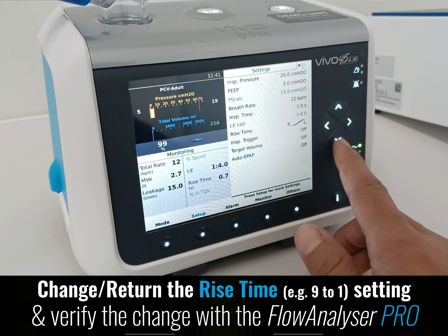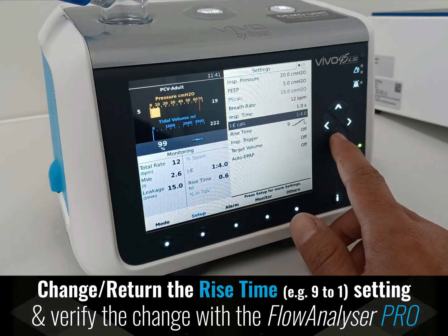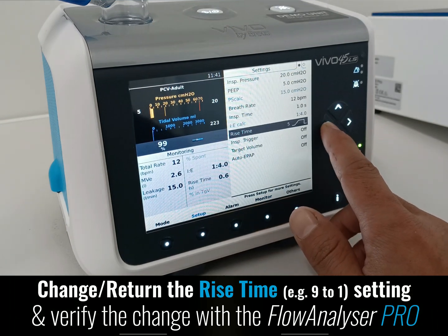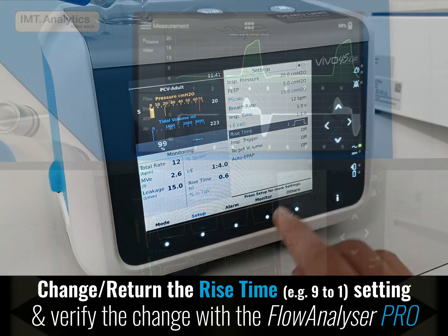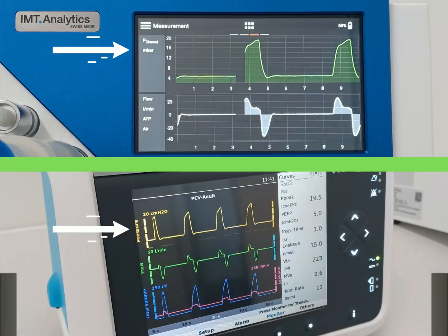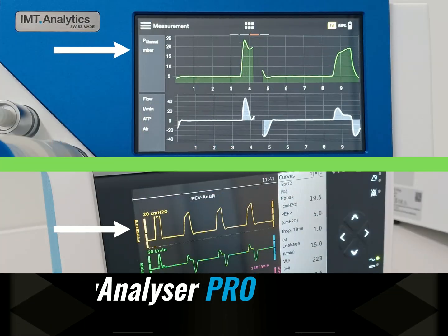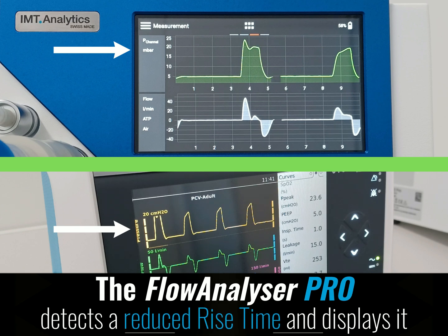Change and return the rise time setting from 9 to 1, and verify the change with the device. The Flow Analyzer Pro detects the reduced rise time and displays it.